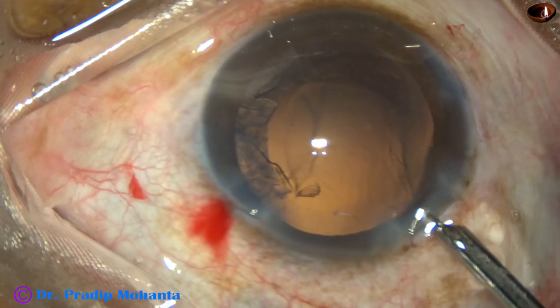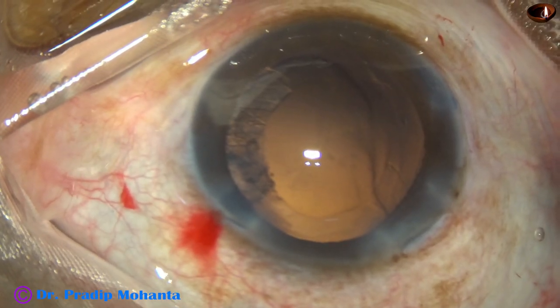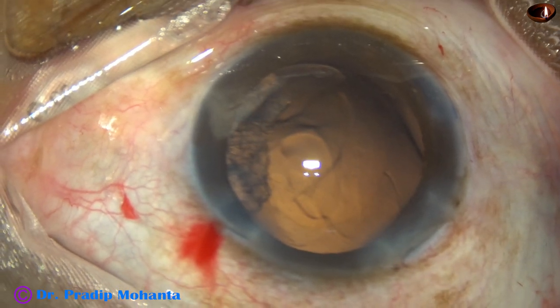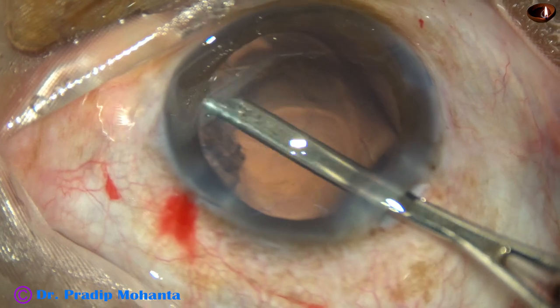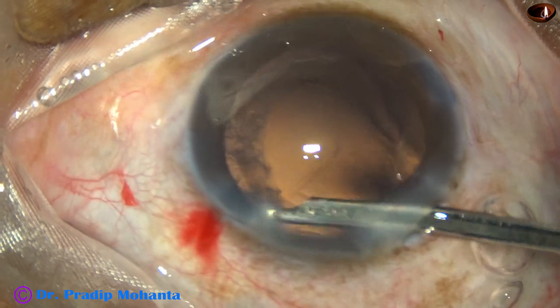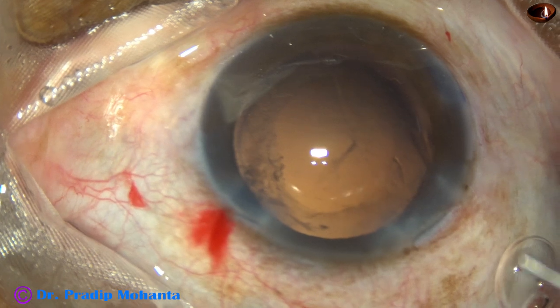I take the Simcoe and try to remove the cortex, but I find that vitreous is tending to come to the aspiration port. So I inject Viscoat again, stop the irrigation of the Simcoe, and do dry aspiration of this cortex — because normal wet aspiration is very tricky here; it can cause a retinal tear by drawing vitreous strands vigorously. This was dry aspiration of the cortex.